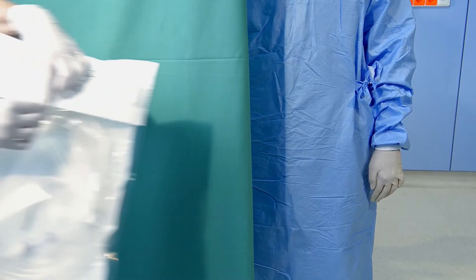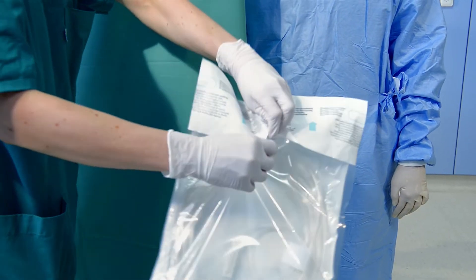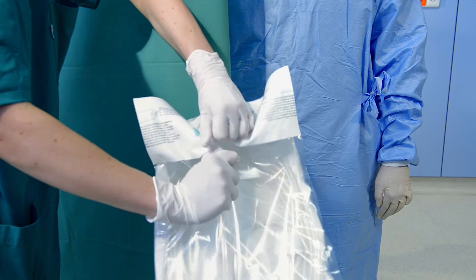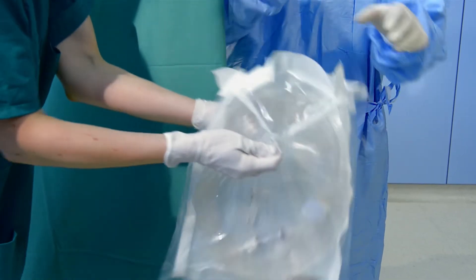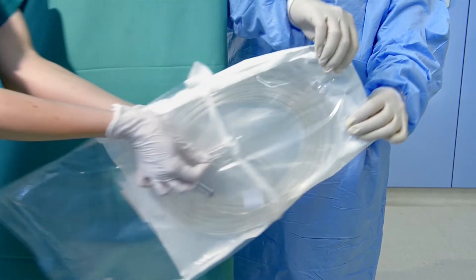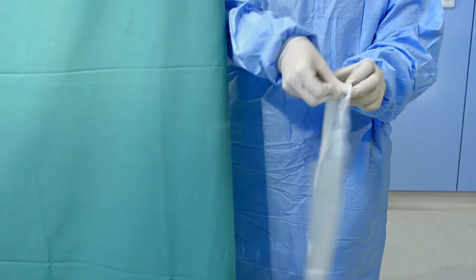The double lumen suction line must be unpacked and prepared at the sterile field. Open the outer packaging. The sterile nurse should take the inner sterile packaging without touching the outer blister pack.